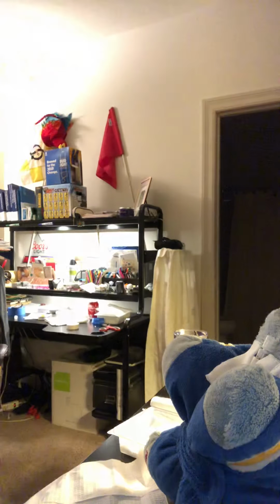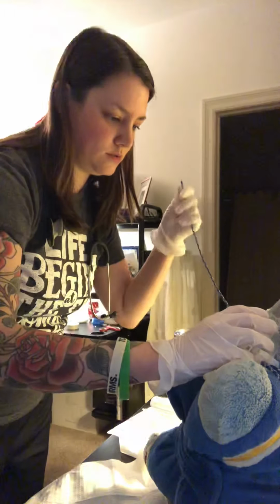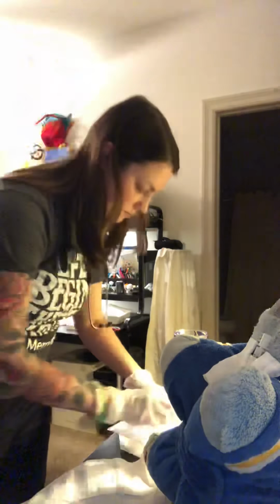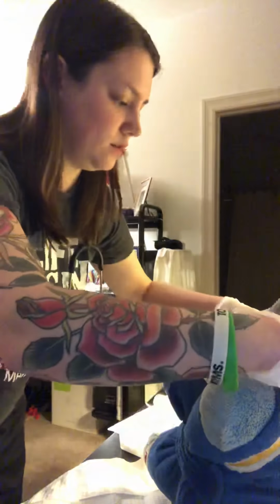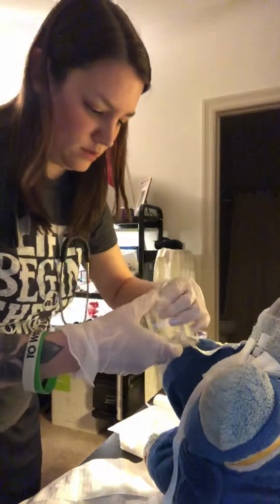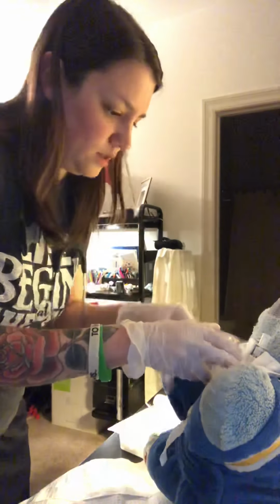I'll go ahead and replace this here. Oh, I've got to replace the collar here. This would be hooked up to something, so put that there.